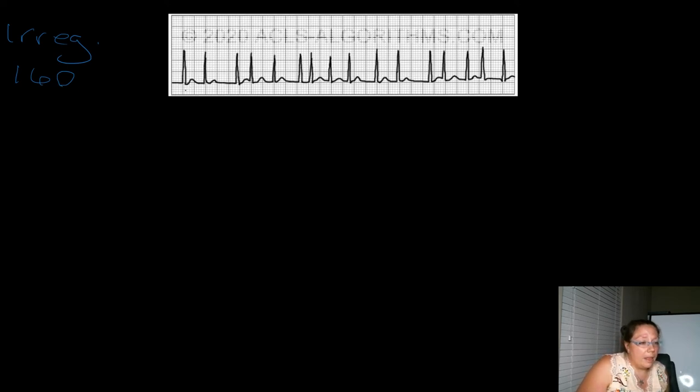Okay. Do we have P waves? Are these P waves? They're not P waves. Are they P waves? No.